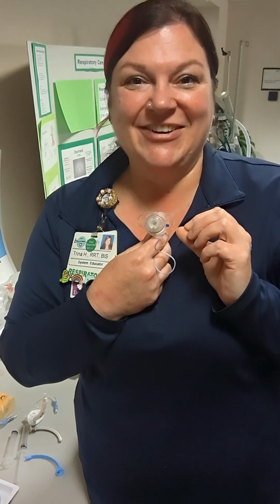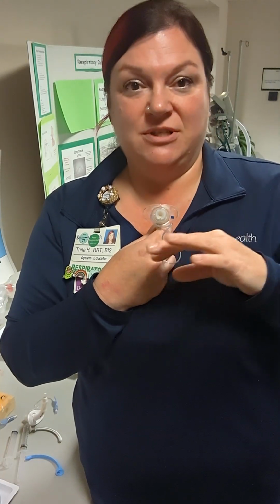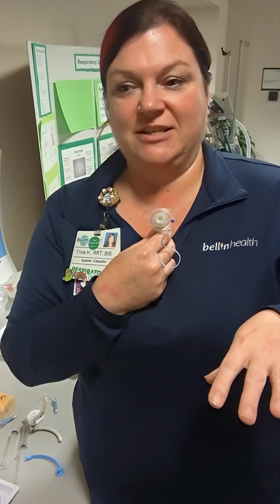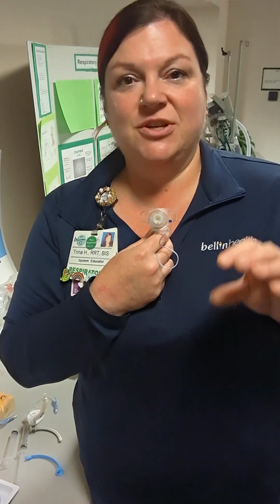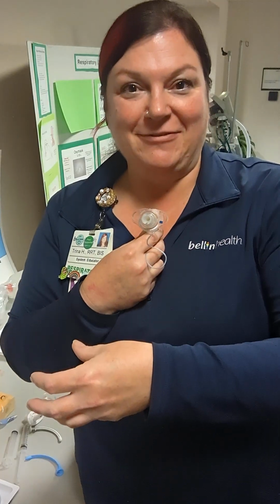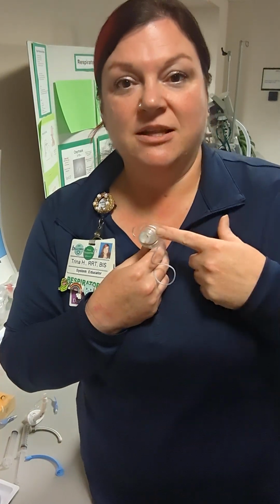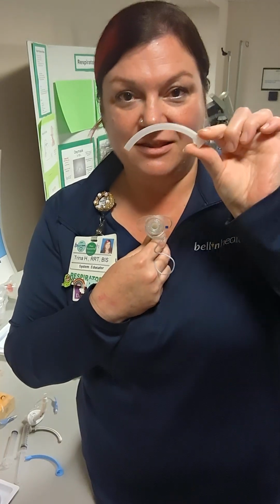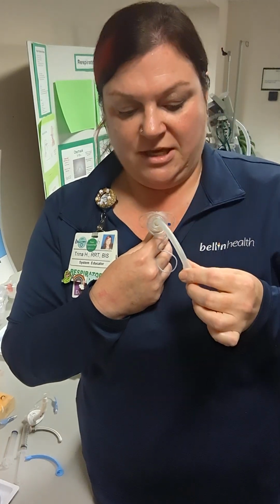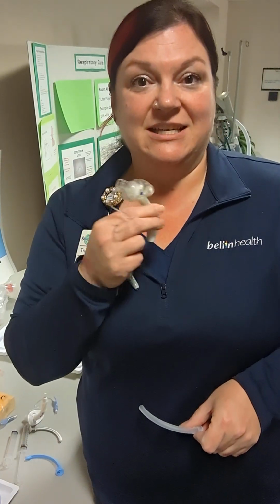I always think of, at Thanksgiving time, we use crock pots in my family quite a bit. And my mom always uses this clear plastic liner inside. I never really understood it until it makes total sense. You can cook inside of that, and then you just take it and throw the liner away. It's disposable. This is exactly the same thing. This is a liner to keep your airway clean. So this is disposable. This is not.